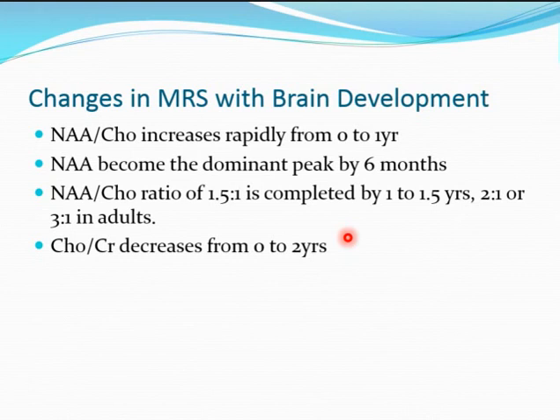The choline/creatine ratio decreases from 0 to 2 years, okay? Because first the choline is high, then the choline will start to normalize.